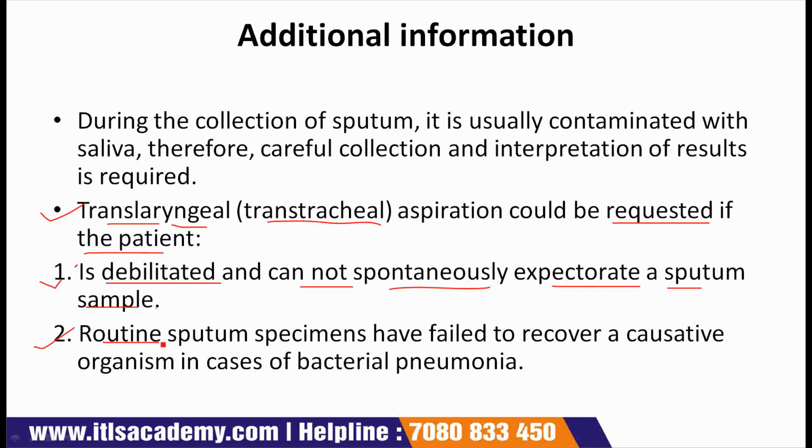Next, routine sputum specimens have failed to recover a causative organism in case of bacterial pneumonia. These are additional information of sputum culture and sensitivity test.